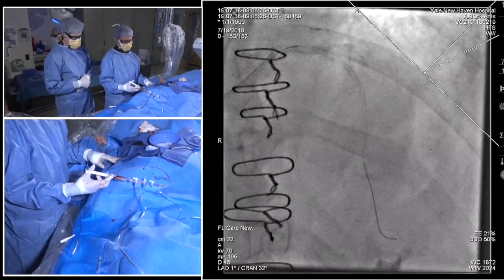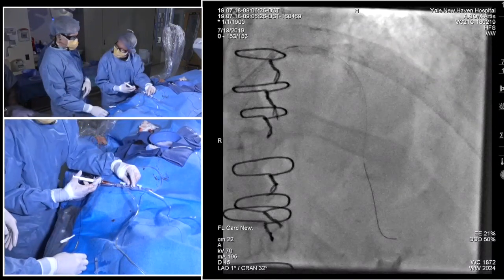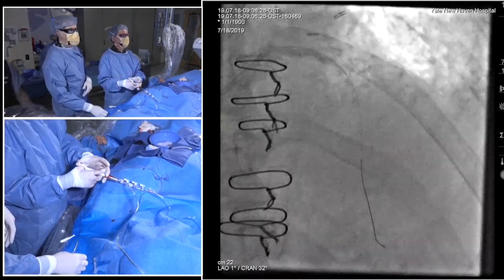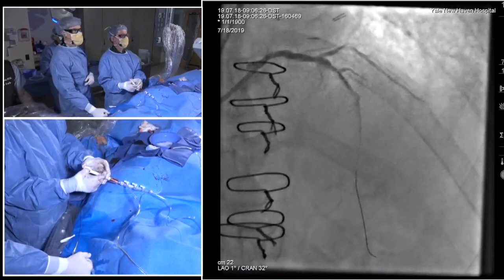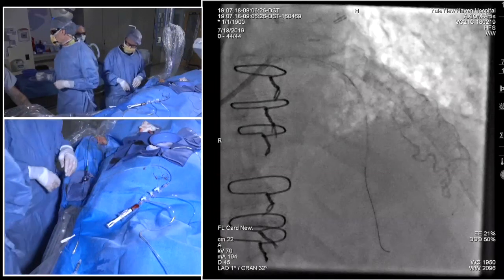So, Kate, let me ask you a question. They did not image first. Obviously, the calcium was severe, so no one's going to fault them from doing rota. Do you image these cases first? And let's say it wasn't circumferential. Might you have chosen a different strategy up front?